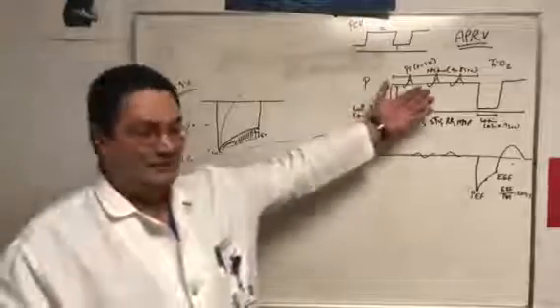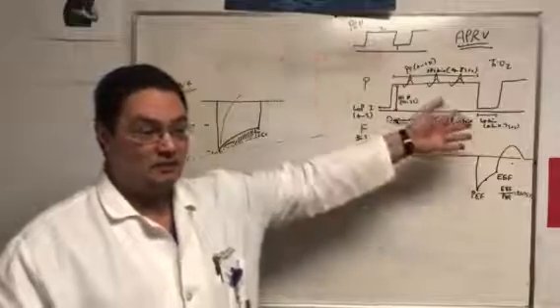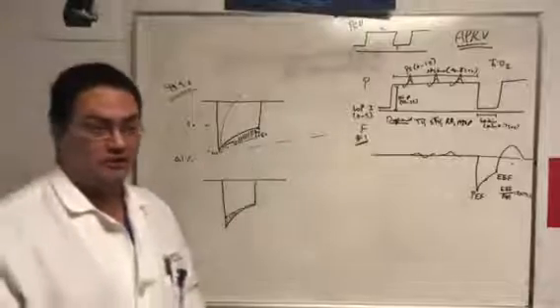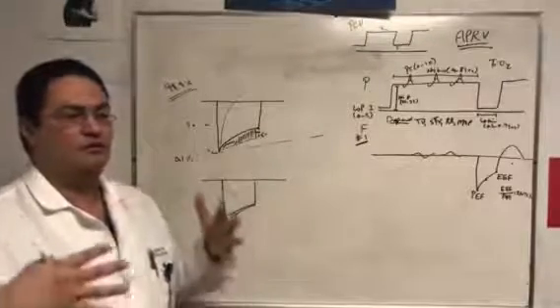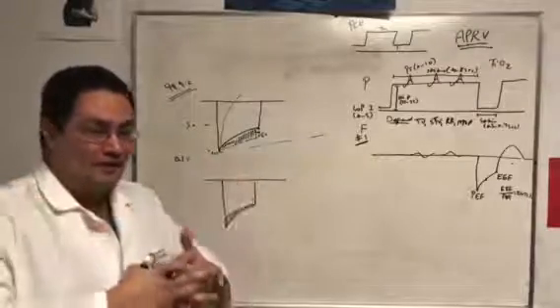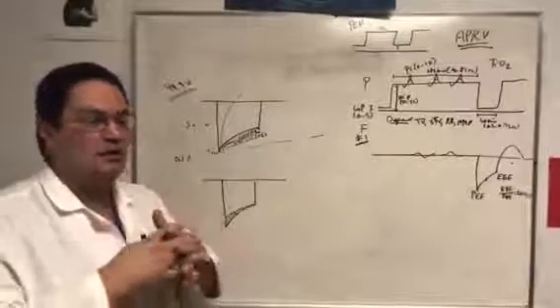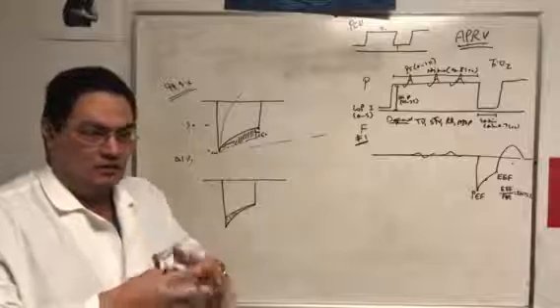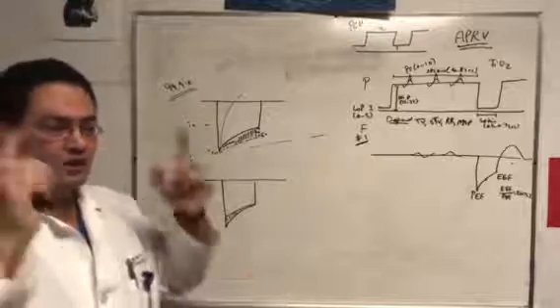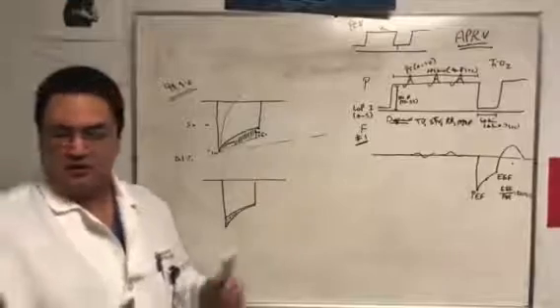Here I'm talking 35 of pressure, right? 35 of pressure for 6 seconds. Show me what bronchus will be able to constrict. No bronchus will be able to constrict here. No. Even if you give calcium, induce asthma, give neostigmine, give acetylcholine, they will not constrict. They won't be able to. It's just the pressure. They can't overcome this pressure inside. So that's another claim to fame to this mode, that you will never ever hear wheezing in APRV. You're not going to be able to hear it.